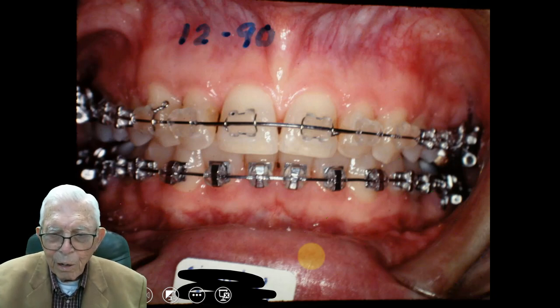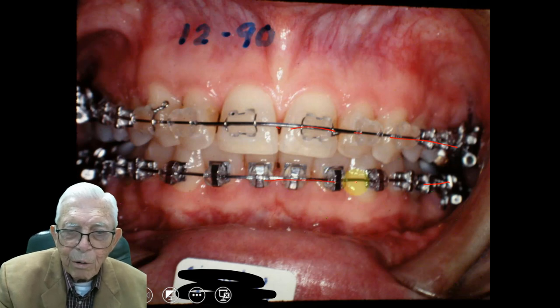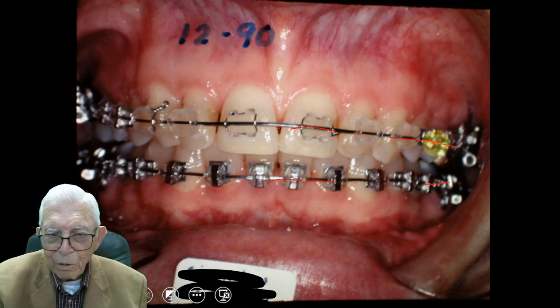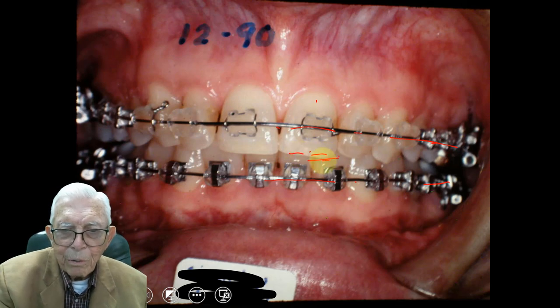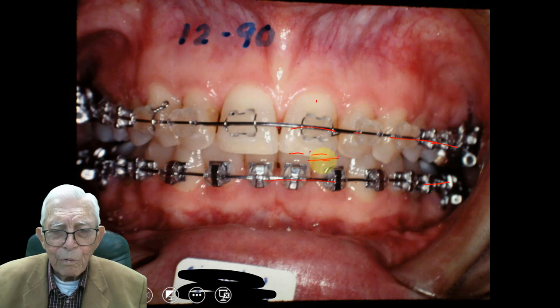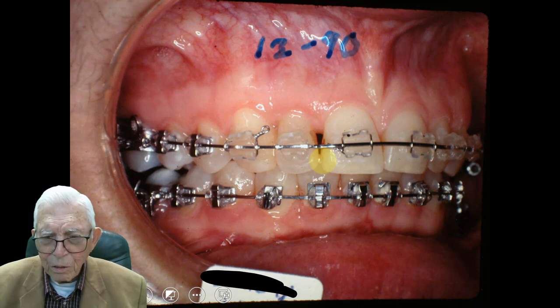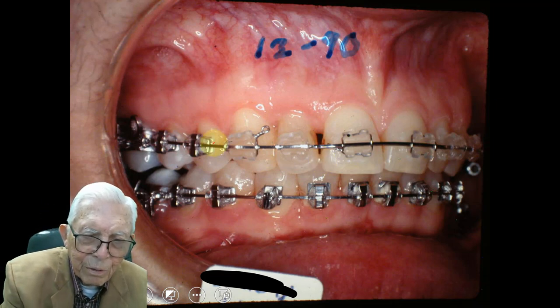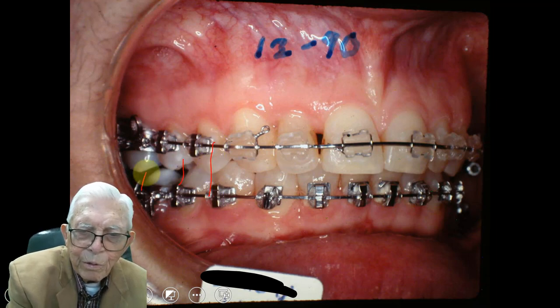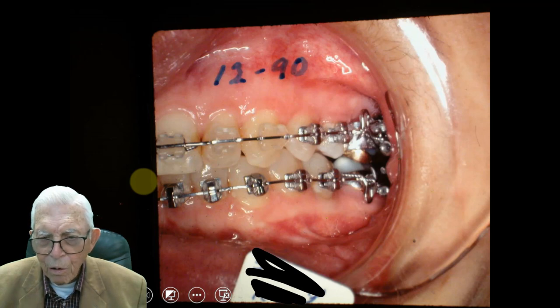Here we're jumping ahead quite a bit. We've already got them leveled out. We put them in a heavy round wire, and this one's a rectangular wire right here. We'll put a rectangular wire up here to level all this out. We should push this tooth up a little bit, or else you've got to trim it down with the incisal edge. But this is December of 1990, and adult orthodontics a lot of times is quick, or sometimes quicker than deciduous or early orthodontics. Now, this cuspid tooth is coming right down in place, and when this levels out it'll be in place too. But it's right in the center, so the midline is off to some extent.